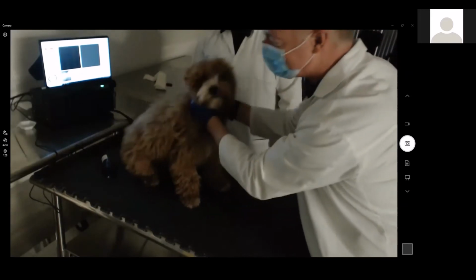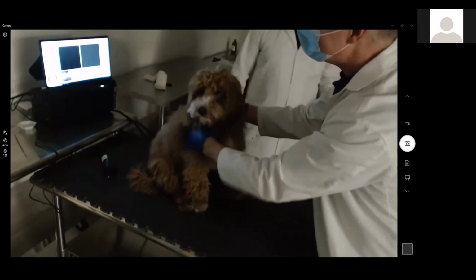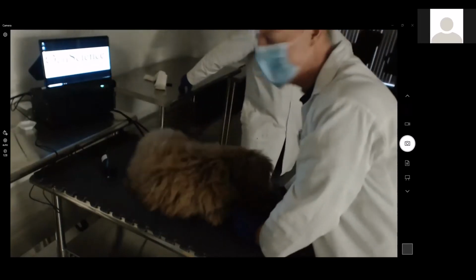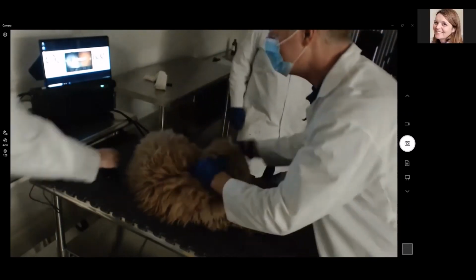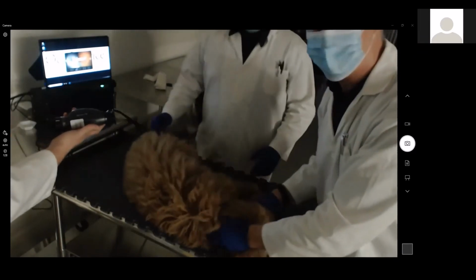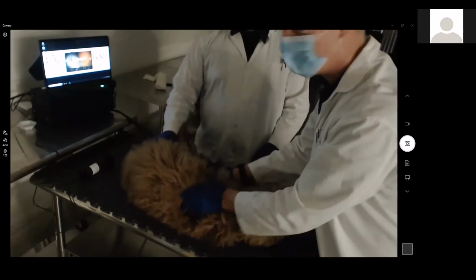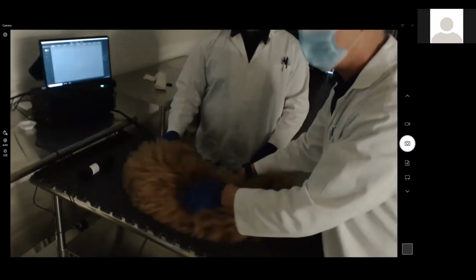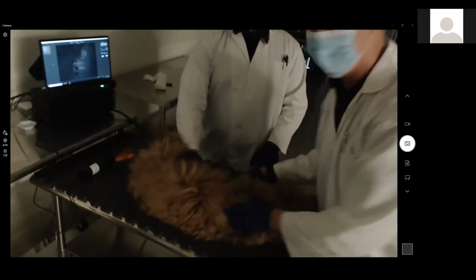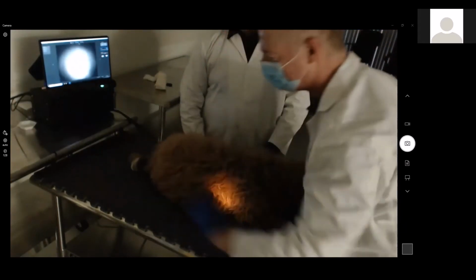The only thing else I can show is we could do a quick fundus on him. I've got a toy that I'm trying out, just kind of curious about it. It's a fundus camera, like other ones that are available. I wanted to bring that to consideration, since we're talking about fundoscopy. Our small fundoscope works really well on the really small animals, but for fundoscopy in the clinic environment, you need something that works better for the larger animals. So that's why I brought this one along, just to make a case in point.